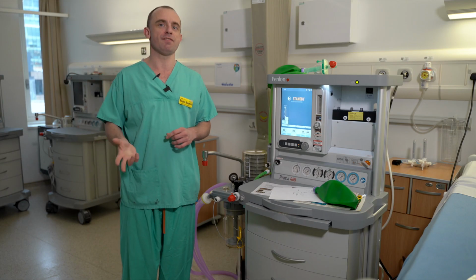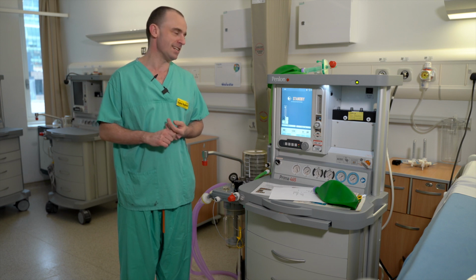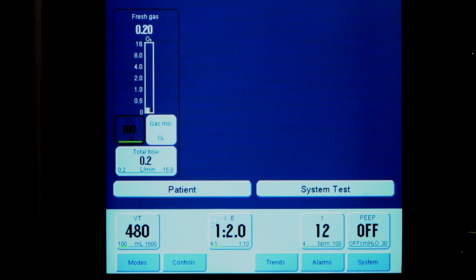So we'd like to start and ventilate the patient. There are two things that we're going to need to think about. Firstly, what mode of ventilation we want to use, and secondly, what gas flow. If we look at the gas flow initially, what we can see here is this dial here tells us what the fresh gas flow through the machine is.